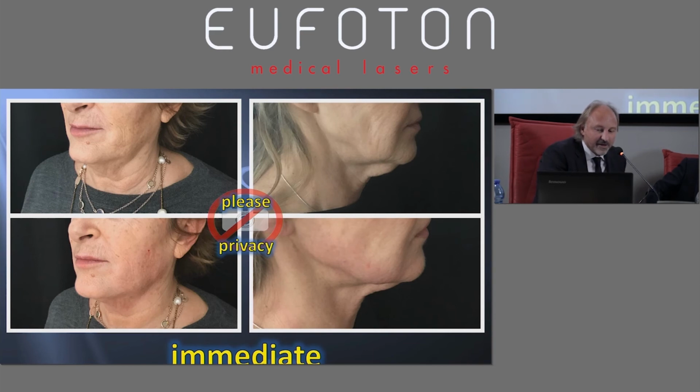Maybe it's not really rewarding, but I think this result is quite meaningful, because 20 minutes between the first picture and the second picture is really rewarding for the patient, but this is not really a result. It comes with some collagen contraction, which is not lasting, and also with some edema of the jaw profile, so it's a sort of deceiving effect.